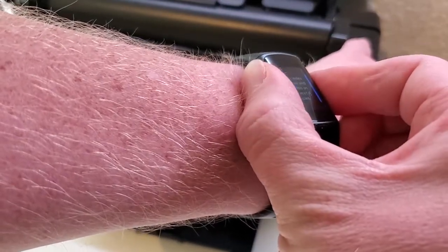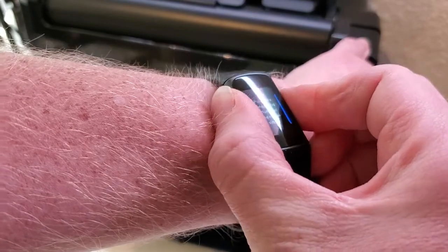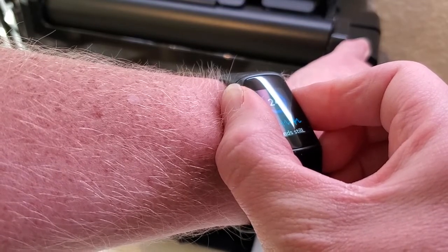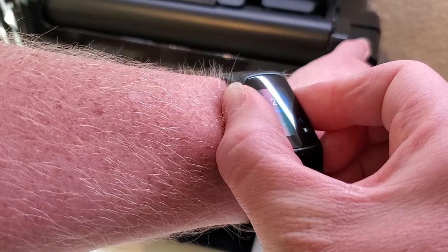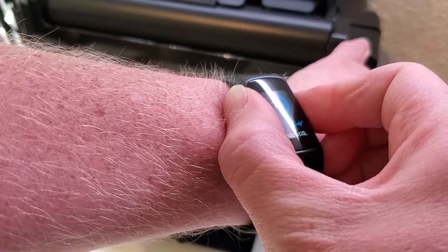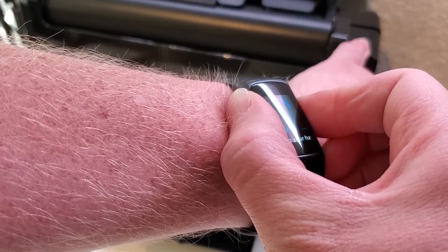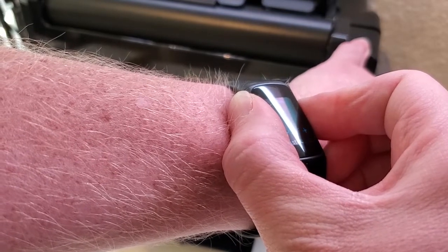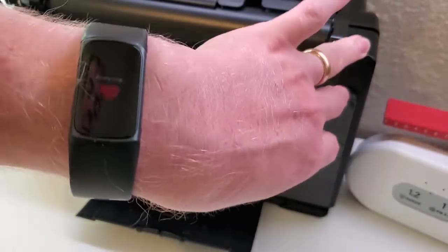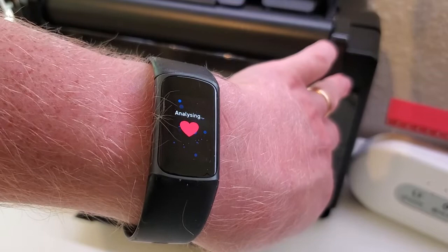It can be a little bit finicky. Once the data is collected, you could see it was a little finicky getting it working, so move your fingers around. Make sure you don't move or talk at all. If you do talk or move, it'll probably start the count over.